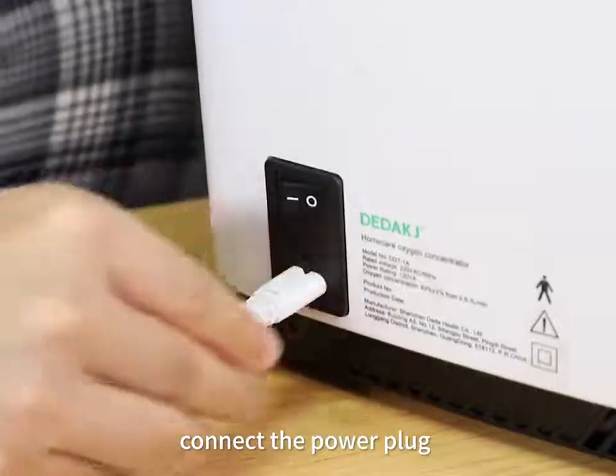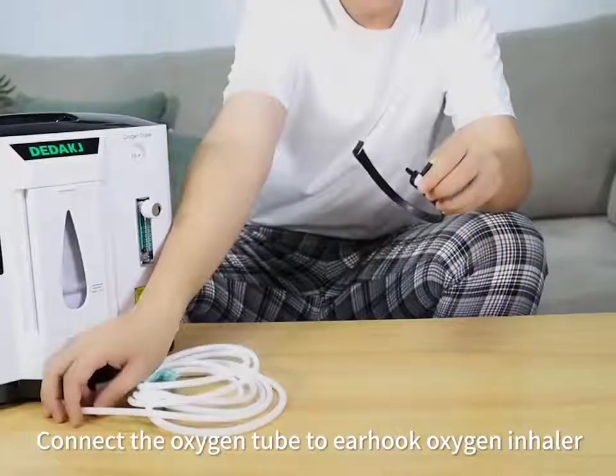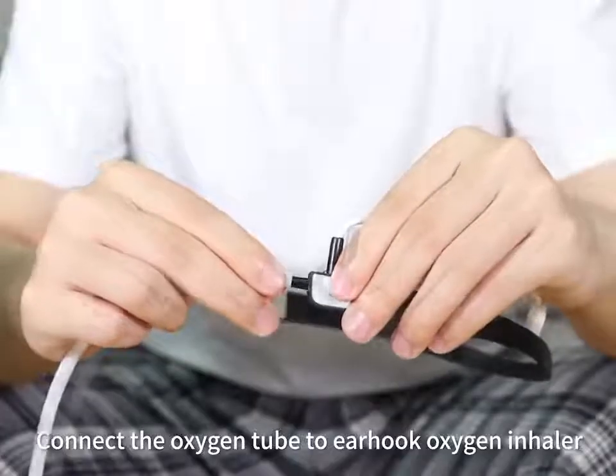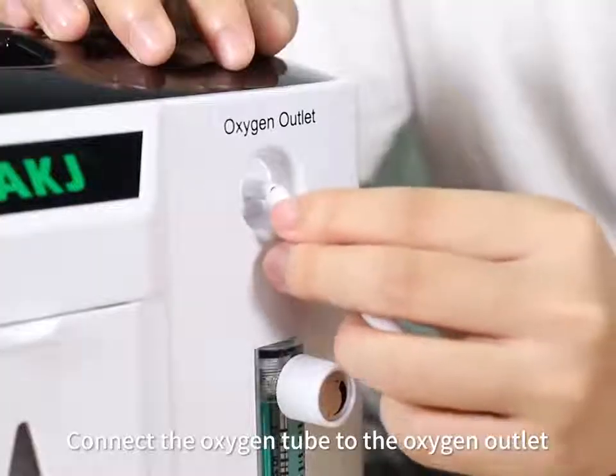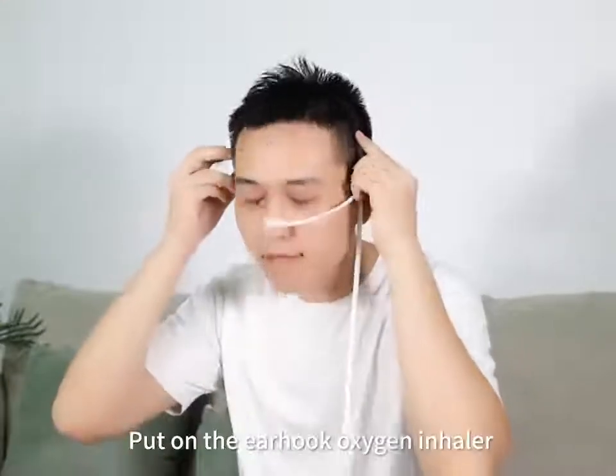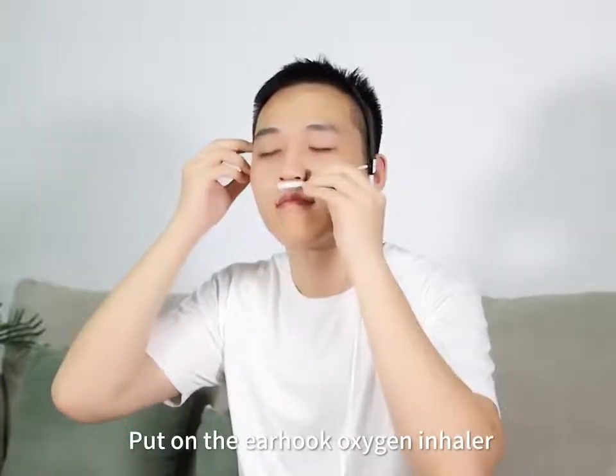Connect the power plug. Connect the oxygen tube to the ear hook oxygen inhaler, then connect the oxygen tube to the oxygen outlet. Put on the ear hook oxygen inhaler.